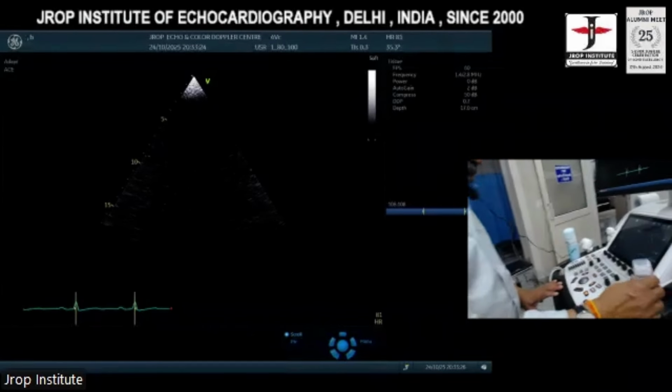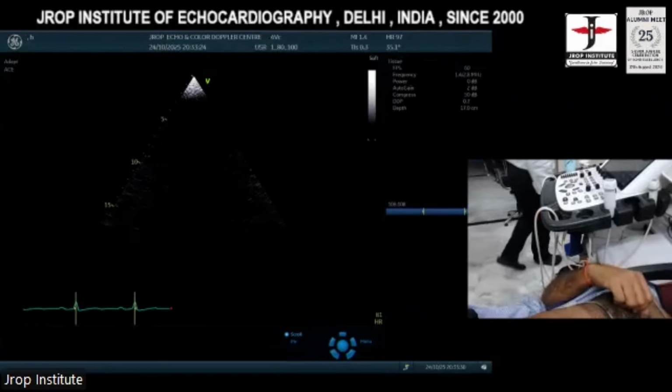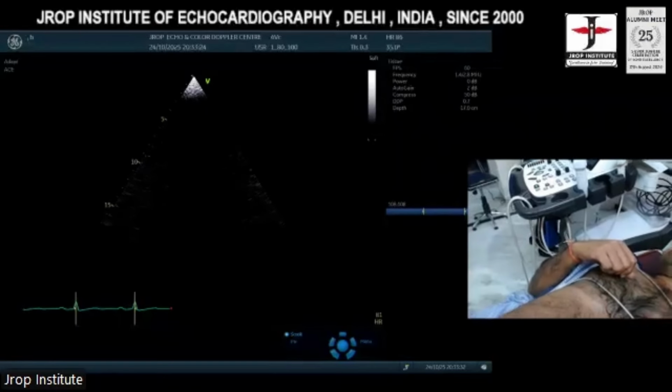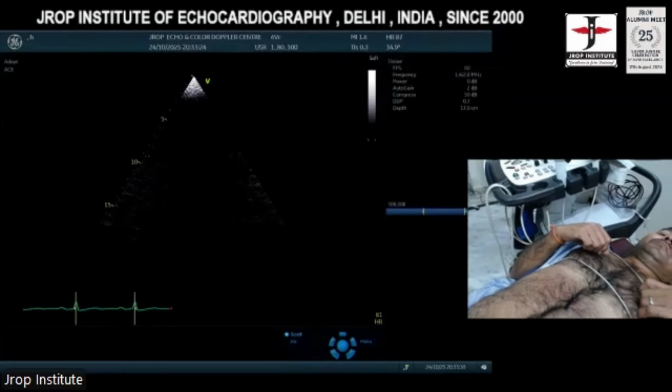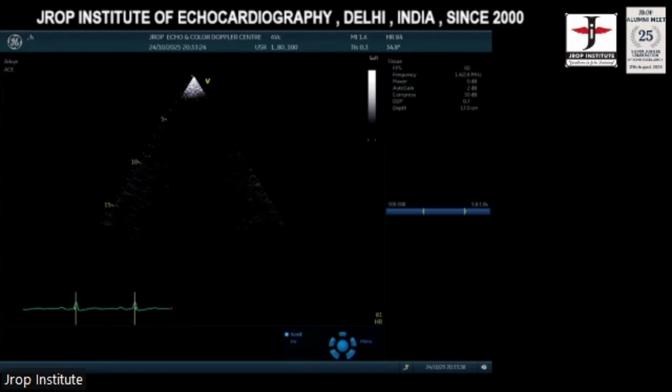And for learners, I always say these words. Once you sit on a machine, you must look at every button. Press and see what's happening to the button. In that case, you'll be able to do very good things. Because the best part of the system is, once you switch off, they go back to the normal factory settings.